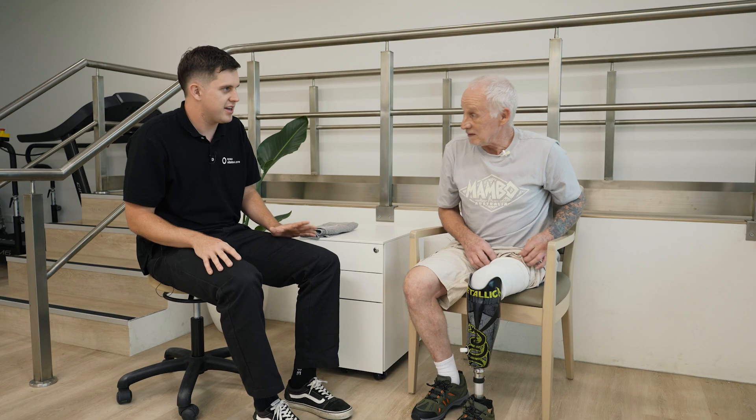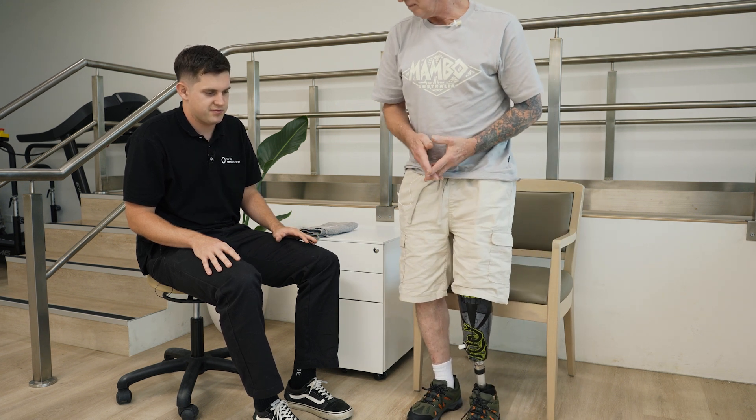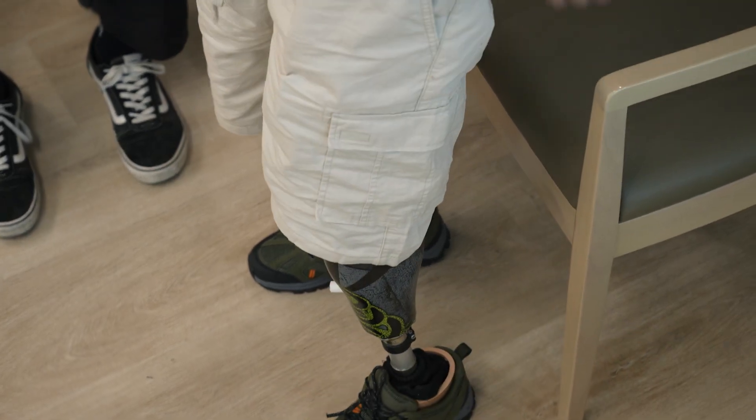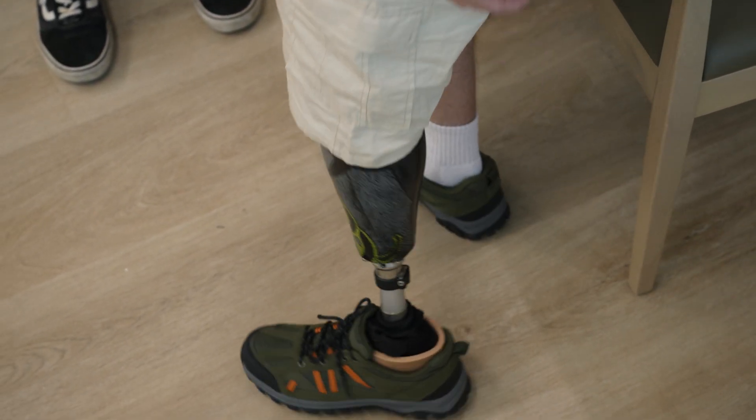Does that feel like it's on? Feels wonderful. Have a stand. What you can do is take a few steps side to side to really ensure that it is on.